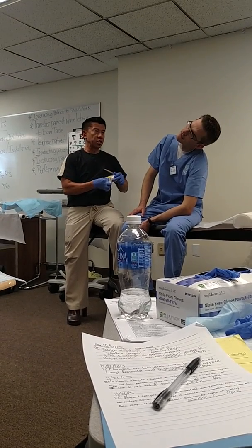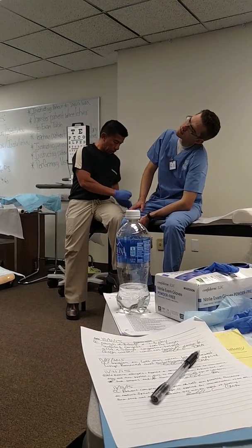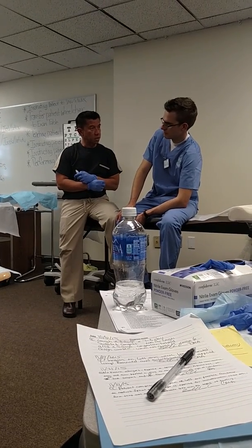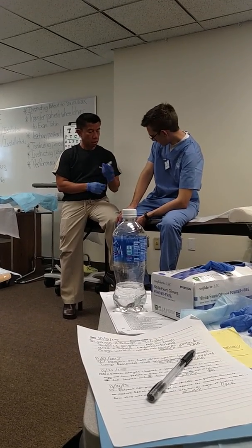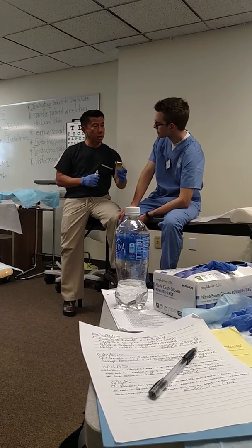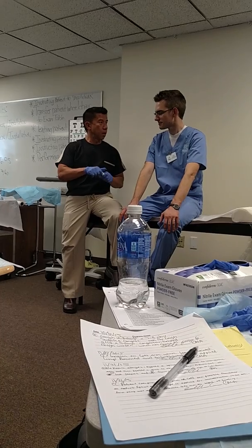Now, you read instructions. Any medication, they always have inserts. Are you allergic to any medication? Are you allergic to earwax medication? Have you used this before? Yes. Okay. Are you okay with this? I'm okay with that. Can you hear me now? Say no.